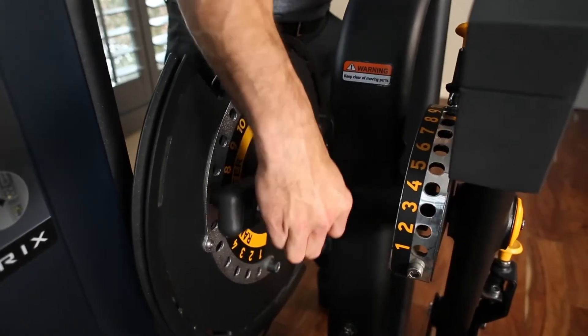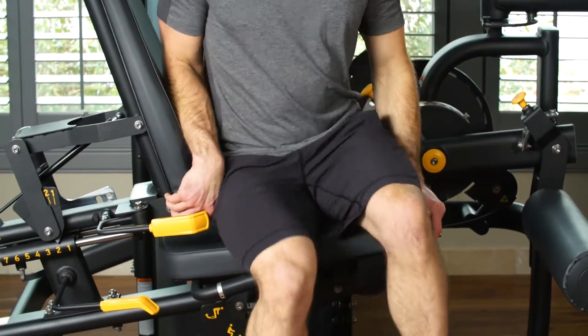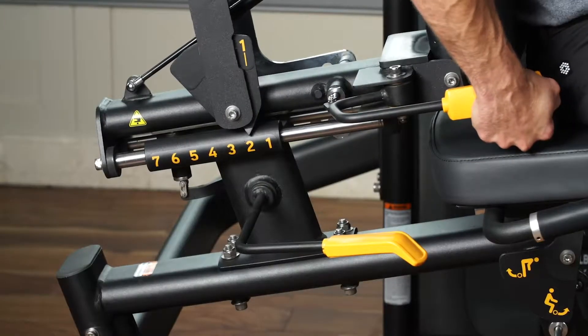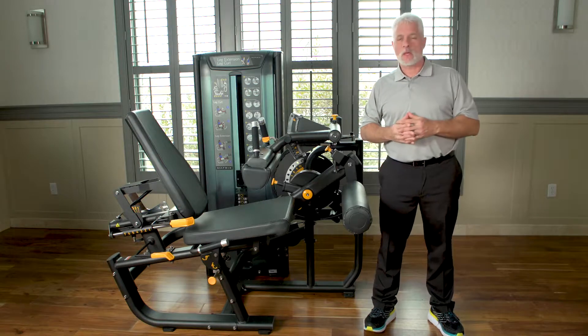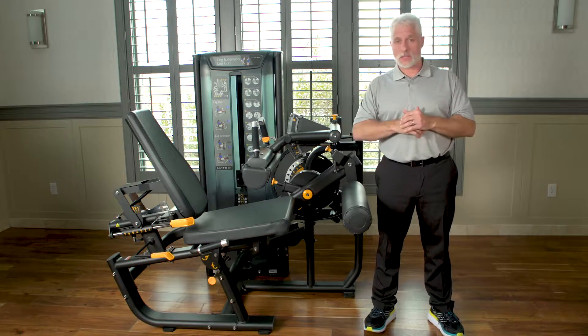It also gives you the ability to range limit, easy entrance and exit. For comfort, you can recline the seat and move it forward and backward, so everything can be adjusted to fit the patient — smaller patients, larger patients, patients that are post-surgical, patients that are small in stature. This machine can fit all of them.